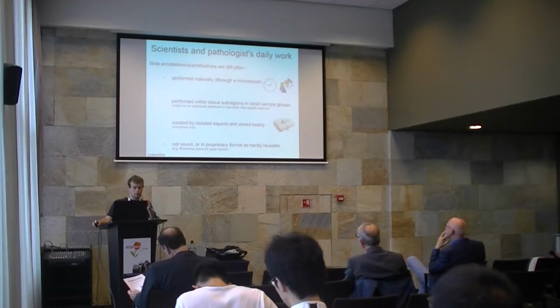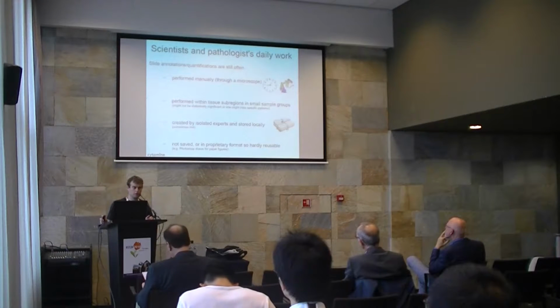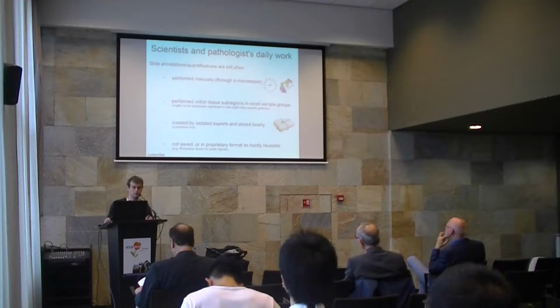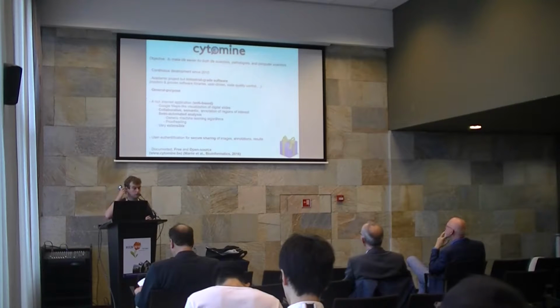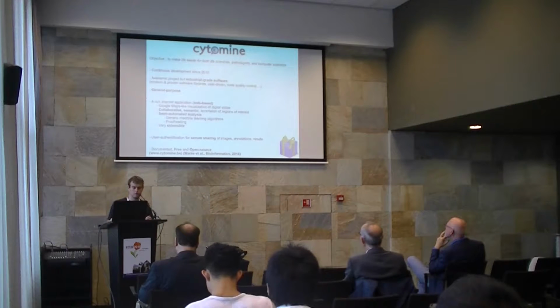We also realized that they are working with proprietary software and proprietary formats, which makes the reuse of this data quite difficult. So, as I said, the objective of this project was really to make life easier for pathologists, life scientists, and importantly the computer scientists who need these images and this ground-truth data to work.